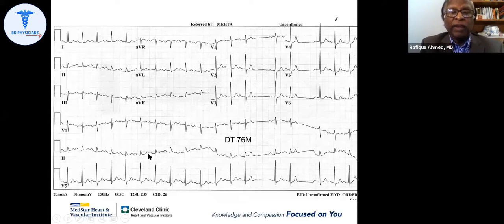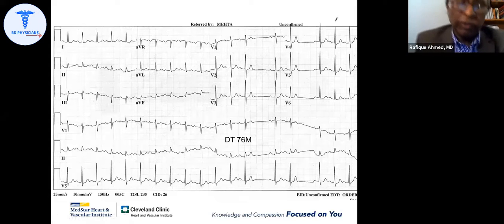If it were sinus tachycardia, it would not suddenly stop. It would gradually slow down and then gradually become faster. So this most probably was sinus node re-entrant tachycardia. It is not an uncommon arrhythmia in older patients. It doesn't have much clinical significance, except that you have to differentiate it from atrial tachycardia and other rhythm problems.